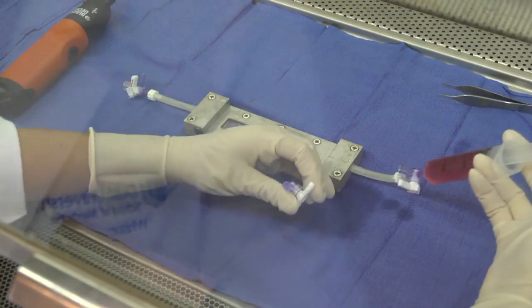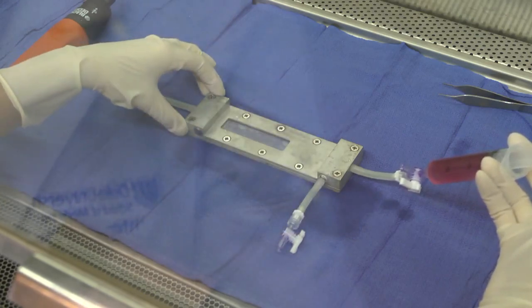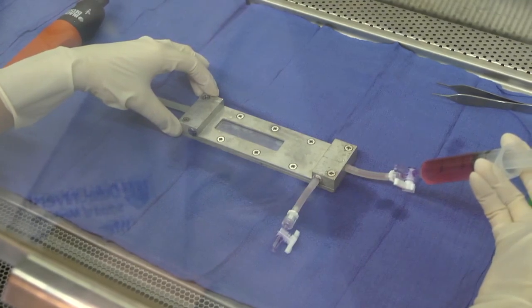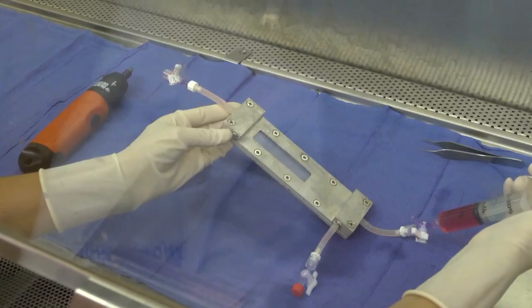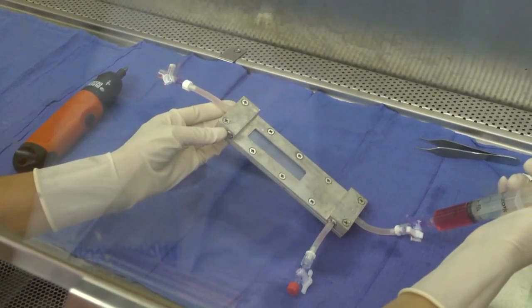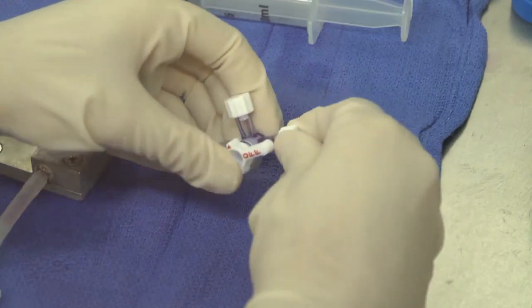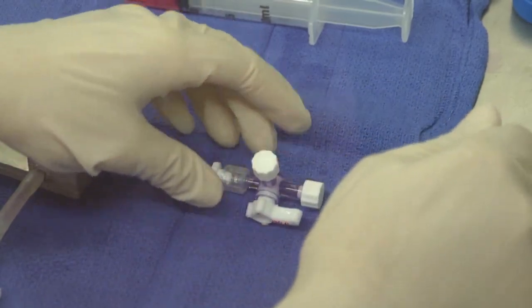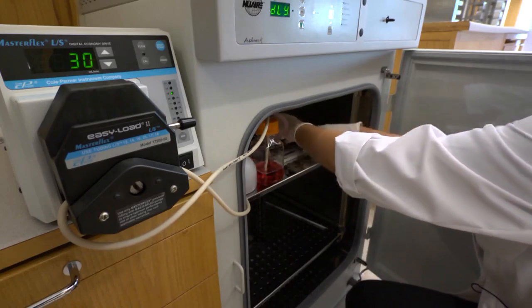De-air the inflow bubble trap by opening the 1-way stopcock attached to the inflow side bubble trap port. Use a 10 milliliter syringe to gently flush the inflow tubing with EPC medium and then close off this stopcock and cap it. Now de-air the chamber channel by opening the outflow port 4-way stopcock and gently flushing EPC medium through the flow chamber, again using a 10 milliliter syringe. Cap all of the 4-way stopcock connections and close them off. Transfer the flow chamber into the humidified incubator with the assembled flow circuit.